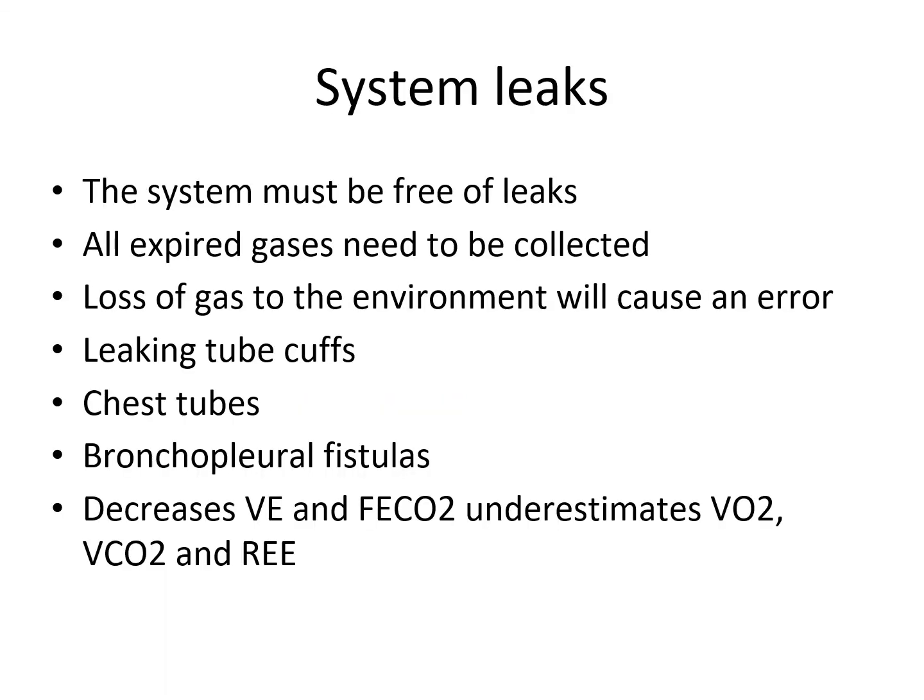You also have to be mindful of leaks. The system must be free of leaks. All expired gases need to be collected. Loss of gas to the environment, so if you have a leak, obviously it's going to cause an error. Making sure your ET tube cuff doesn't have any leaks.